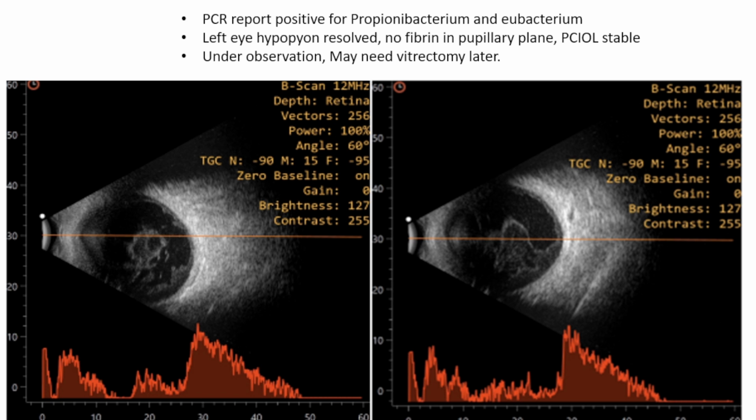What was the fundus view at the last visit? What is the vision? After 2 injections, the patient came for follow-up. Fundus view was there till the second order vessels were seen, and so vitrectomy was deferred. As of now, the patient will come to the clinic today. The clinical picture is more important than the ultrasound to decide on vitrectomy, right? The patient will come for follow-up maybe tomorrow.